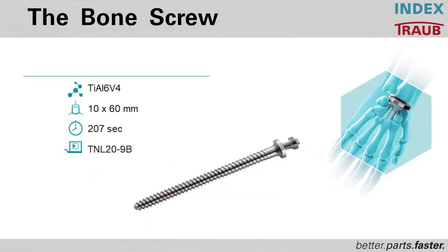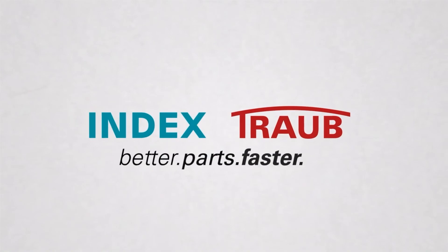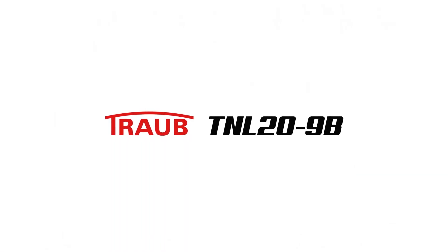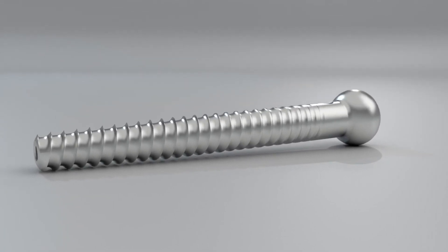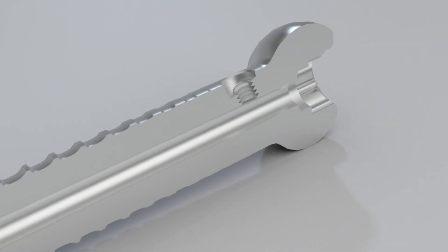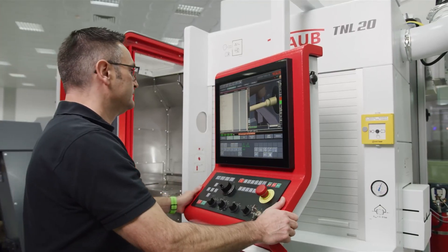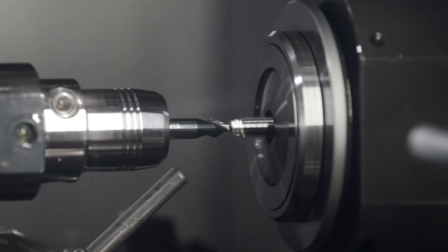We are now showing a bone screw being manufactured on the machine itself. This is a 10 millimeter bar diameter by 60 millimeters in length, with a cycle time of 207 seconds, being manufactured on a TNL20-9B with the interactive B-axis integrated into it.